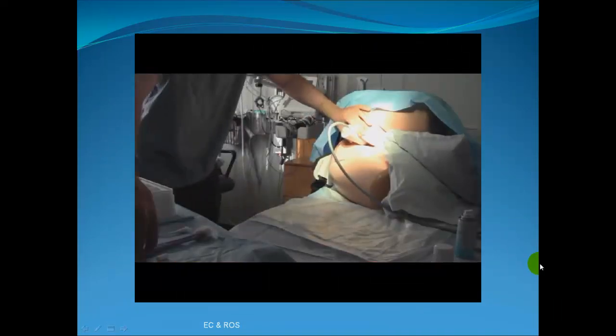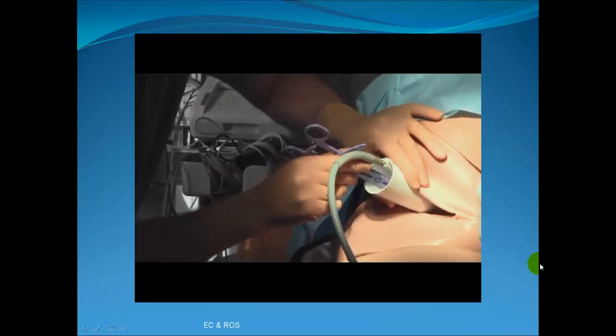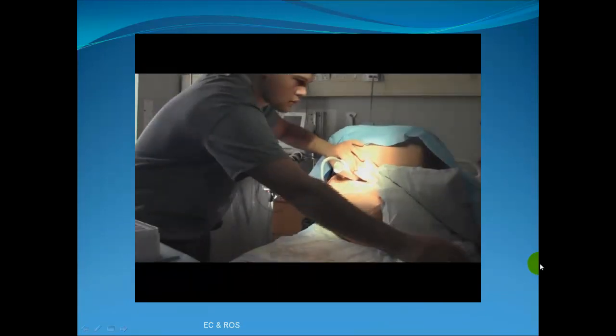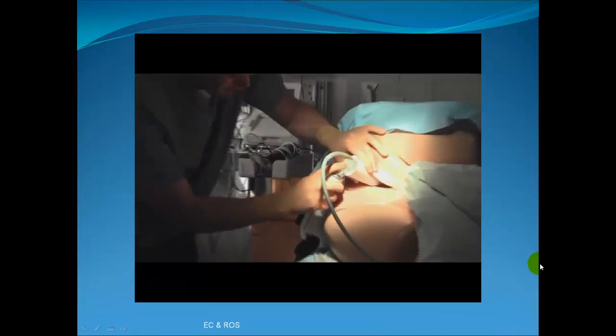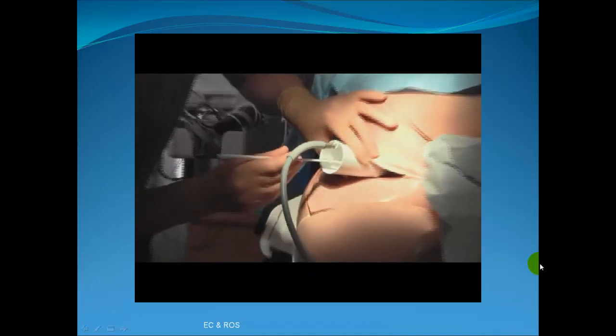When applying ethyl chloride spray, a second glove should be worn and then removed, maintaining sterility. Alternatively, an assistant may apply the spray. This spray provides some anesthesia to the area and increases blood flow by causing local vasodilatation. Gently rubbing a long swab on the area further cleans the area and encourages local blood flow.